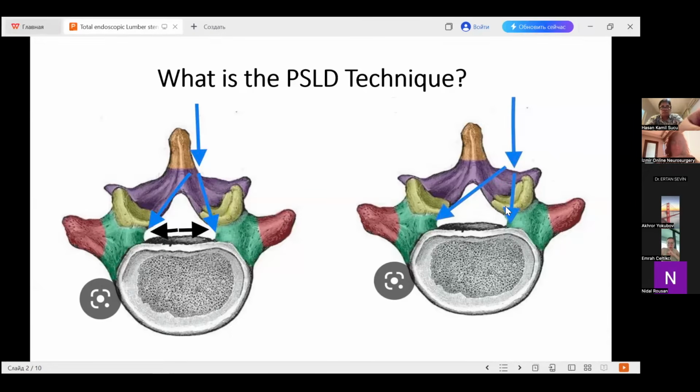I think this technique is also good, but not all the time, because in more than 60%, 70% of my cases there is herniation with stenosis. If we do this simple discectomy, it is not a full surgery. My technique is basically that the landing point should be on the spinolaminar junction.